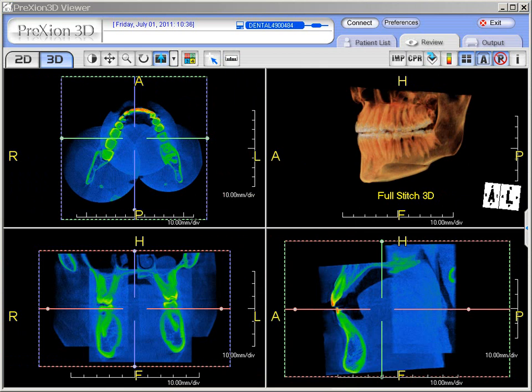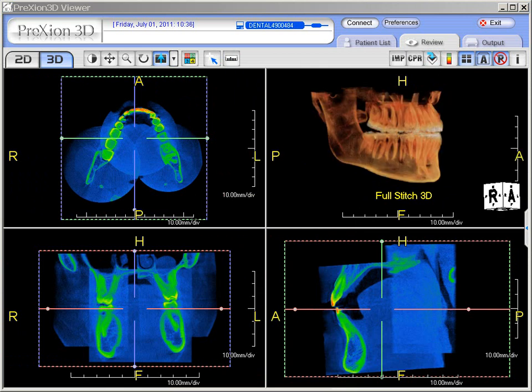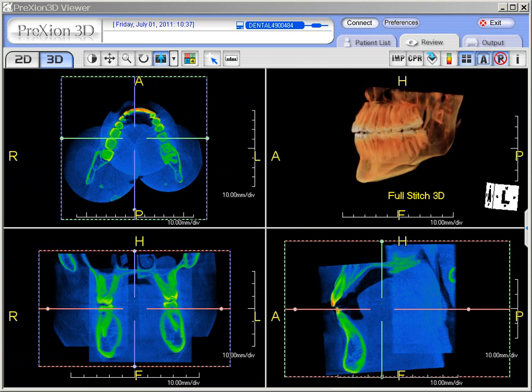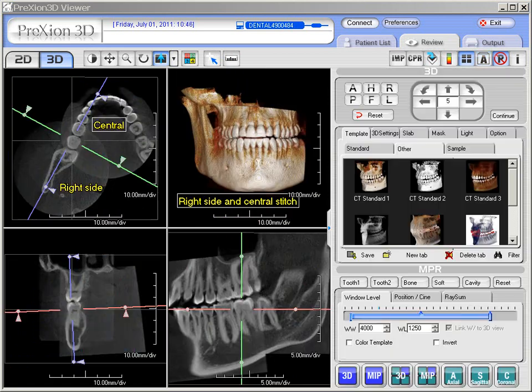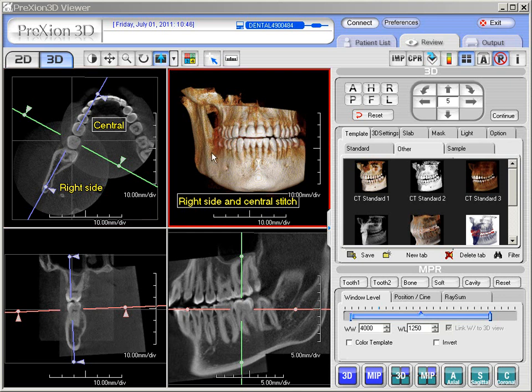Let's step back a few steps and discuss how we obtained all this data and how we put it all together. The fusion of data sets are done two at a time. Here in this example, you can see that we have fused together the right and central data sets, and this is the stitching completion. What will occur next is we would take this stitched data set and then apply the left side as an additional stitch.